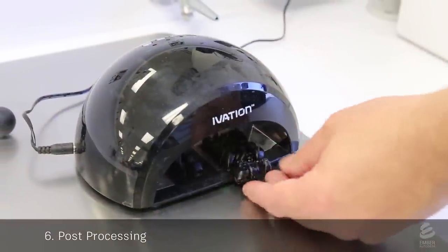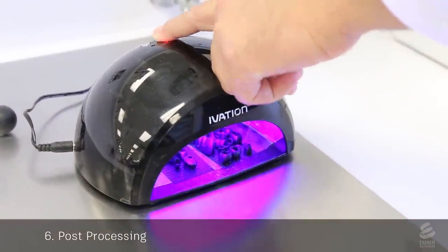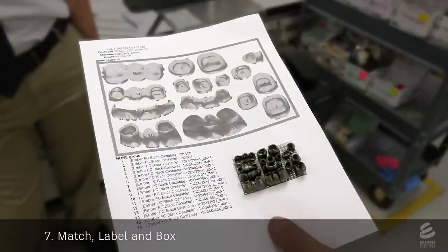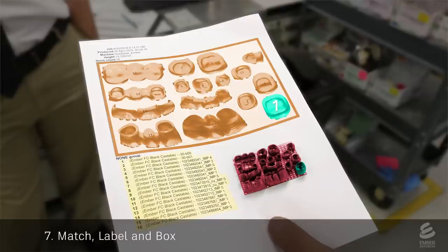Then the print goes through a post-curing step under a UV lamp. Because the print can have multiple crowns from multiple patients, they create a sheet for each print. The sheet has an image that matches each crown and coping on the print with a specific patient. For example, the image labels crowns number 1, 2, and 3, which match these crowns on the print and these cases for a patient.